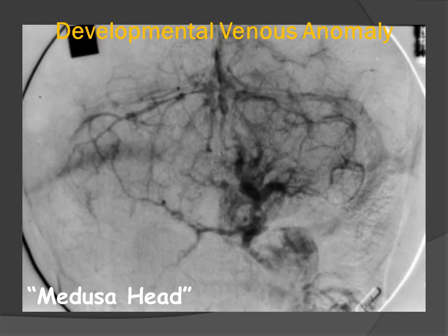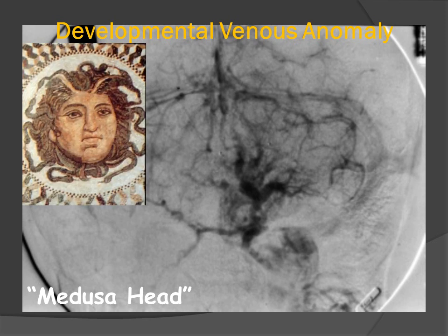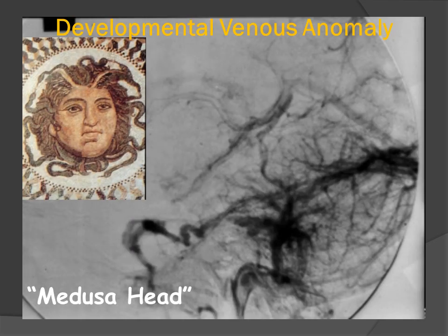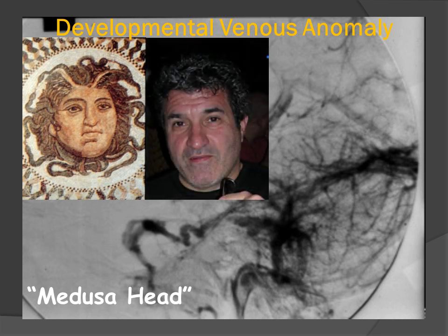Here is another posterior fossa developmental venous anomaly seen on the venous phase from a vertebral injection. Again, we have the appearance of multiple collector veins draining into a dominant transcortical vein. But to my eye, this does not look like the Medusa head as seen in this ancient Greek mosaic — it looks much more like my brother Peter, rather than the developmental venous anomaly.